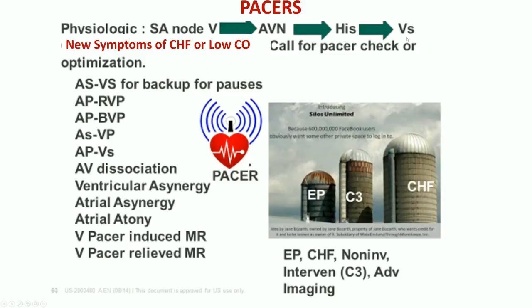That's physiologic, and it turns out that's the best method of depolarization that's possible because it results in sequential AV activation, and it results in activation of the left ventricle then the right ventricle, and so you get everything just perfect in terms of delivering a stroke volume.